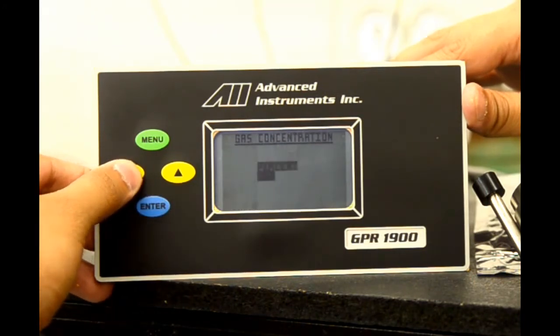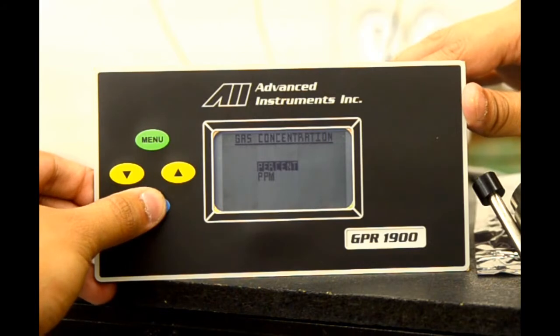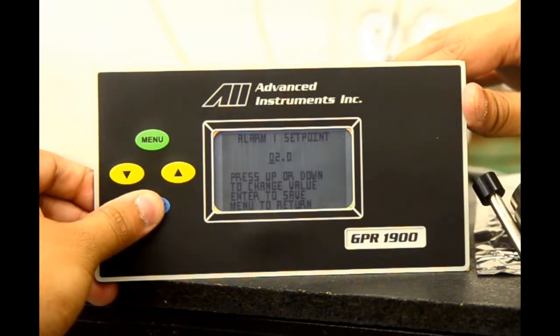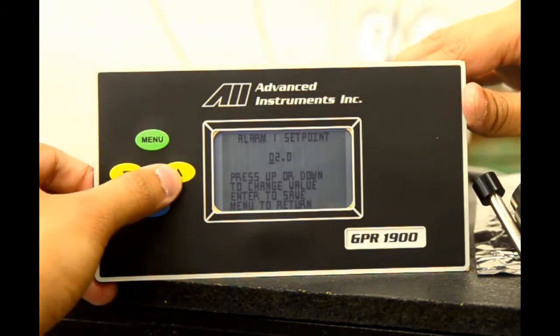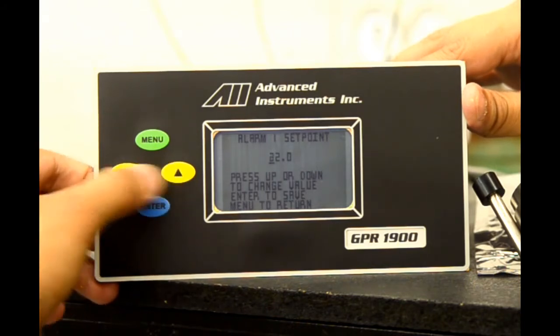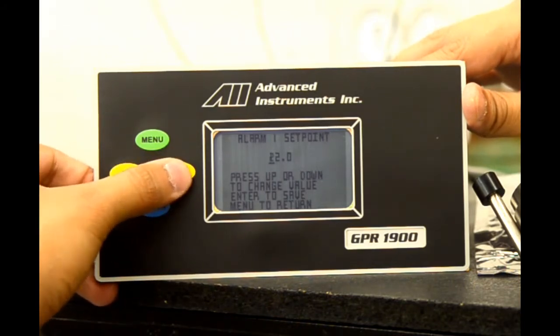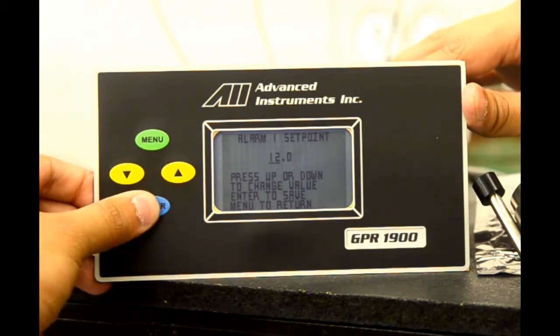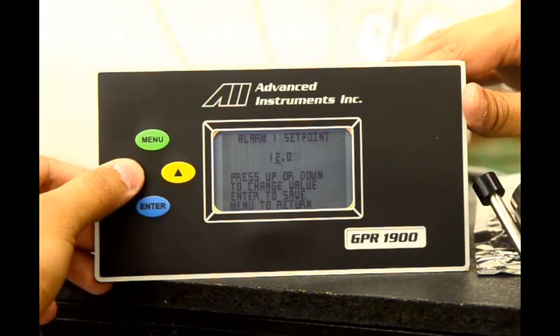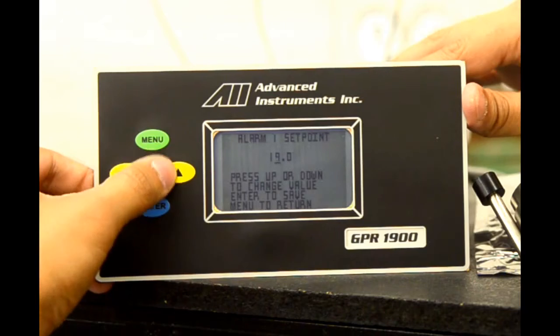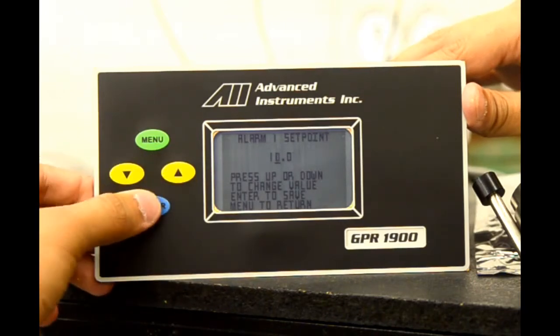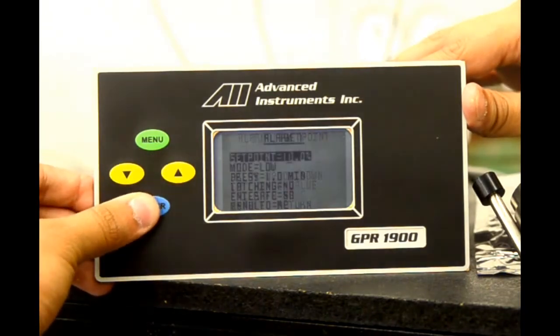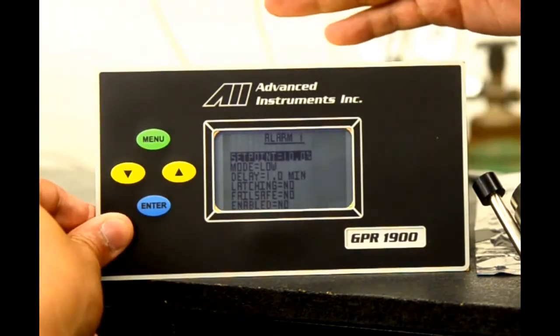We will now set the set point. Select enter and you're brought to percent or PPM as an option. We will do percent. We select enter on percent and are taken to the alarm one set point menu. Here we can scroll up or down to change the value that the cursor is under. We will select 10%. We select one, then hit enter to move over. Again, up or down to change the value. The alarm is now set at 10%.